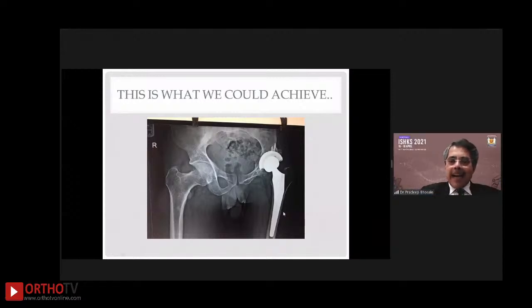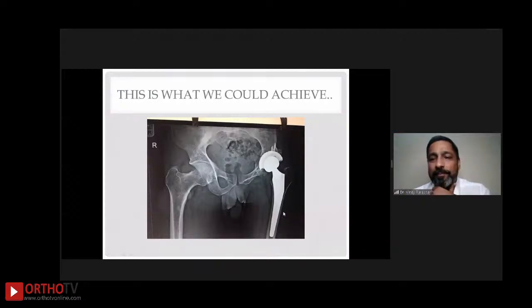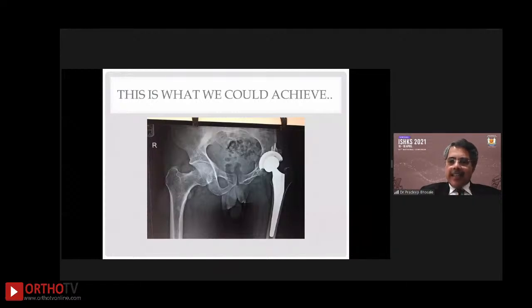Now, one important thing is here the spine is mobile and there is no fixed pelvic obliquity. So whatever apparent shortening there is, everything will get corrected. Soft tissue will get stretched. And I think the hip is quite stable, which he has confirmed on the table. It is a little more closed, but it is okay, acceptable. And he will do well over a period of time.